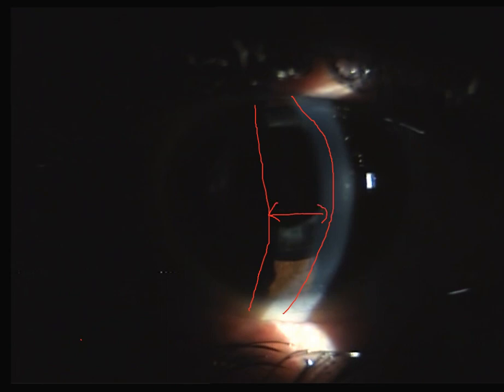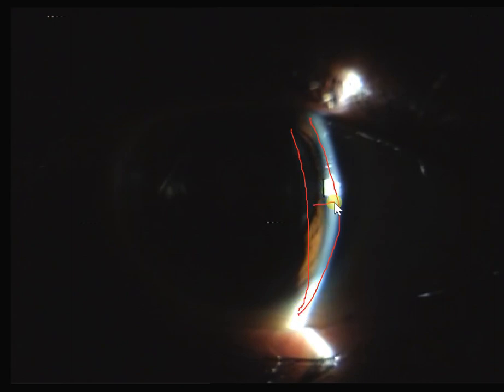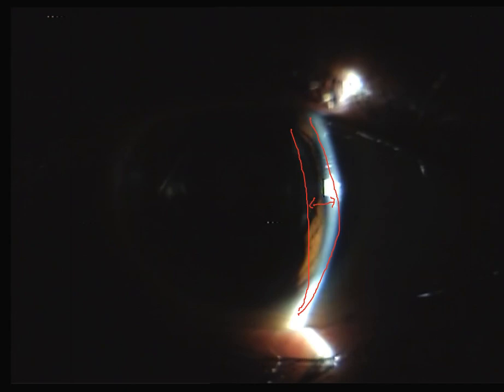Move the slit over to the other side and you will see that this area becomes thinner as you move across. The slit is positioned here and the distance has become narrower in this area - the anterior chamber is shallower on the sides compared to the center.